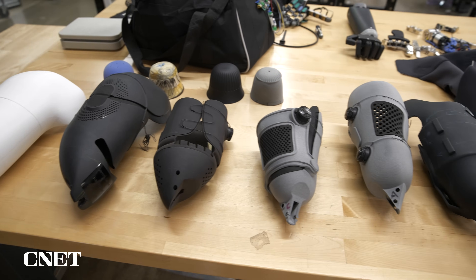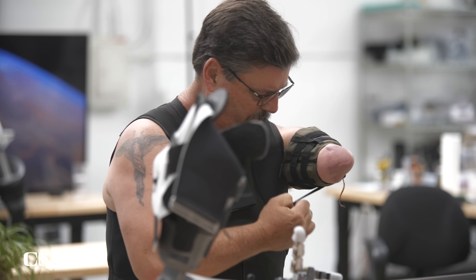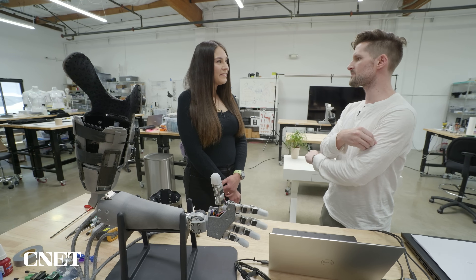The way that you feel is there are haptics in the socket. The user puts on a socket, they attach the arm to that, and inside that socket, when each of the fingers make contact with anything, they get a little buzz — kind of like on your iPhone or your Apple Watch, how you get a little buzz sometimes.